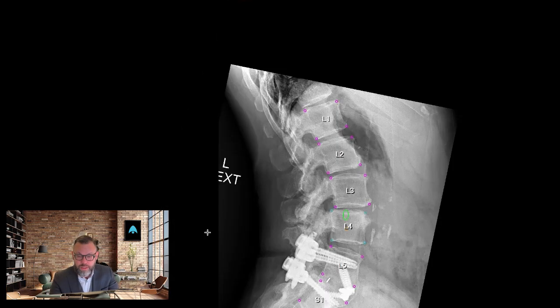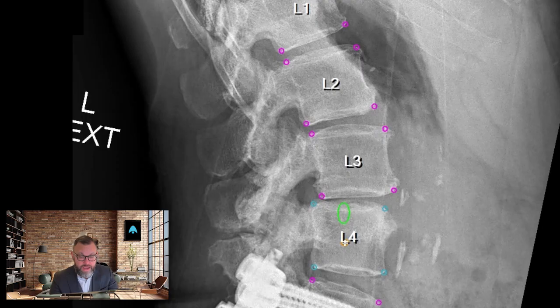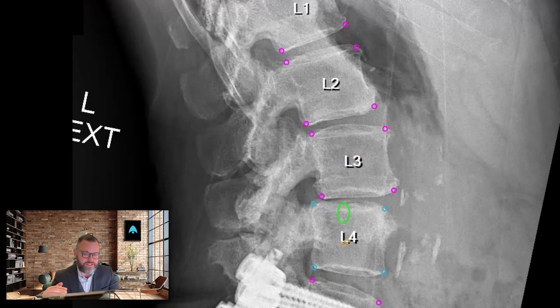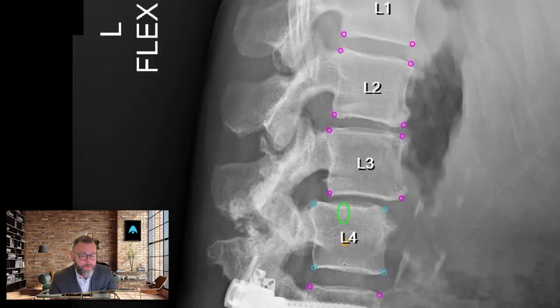Now, even more importantly, when we go down here, we see that the dot is actually getting farther away. So as we move down her spine, what we're starting to see is she's getting worse and worse and worse. And what's interesting about this is that she's getting worse mechanically as she gets closer to the spinal fusion, right? So you hear things about adjacent segment degeneration, adjacent segment disease, all of these things, all of those biomechanical processes relate to that disease process, which means that the segment closest to the hardware is going to wear out next. And this is what SpineCAMP is telling me is happening, right? What we do about it is up to me.